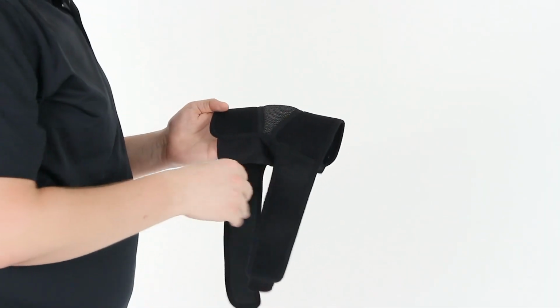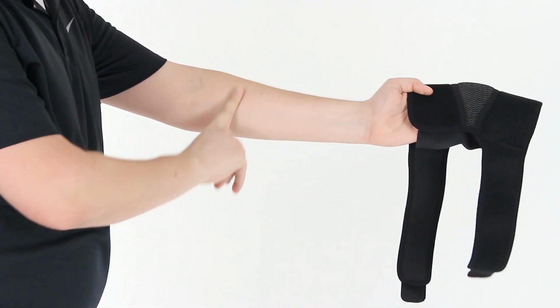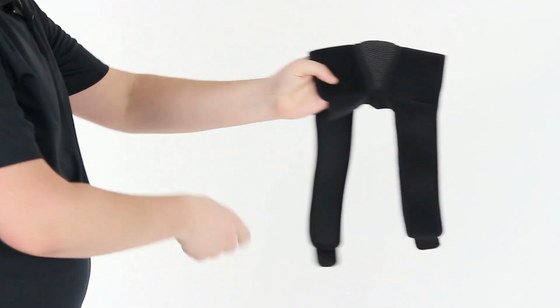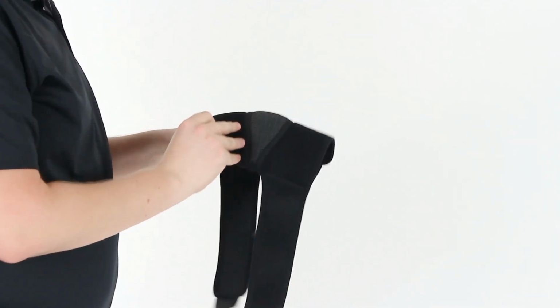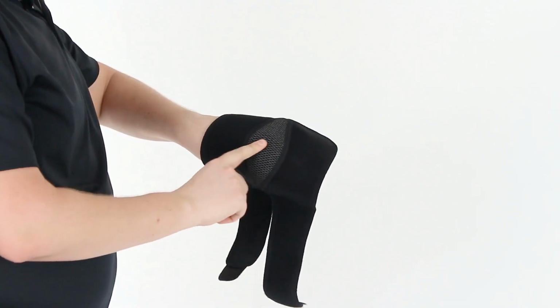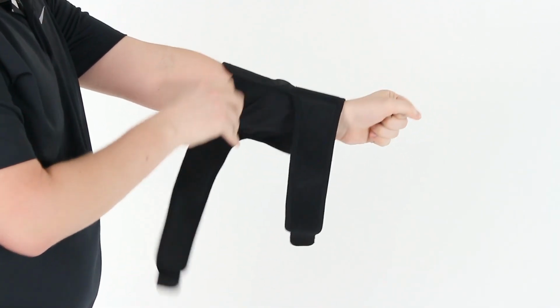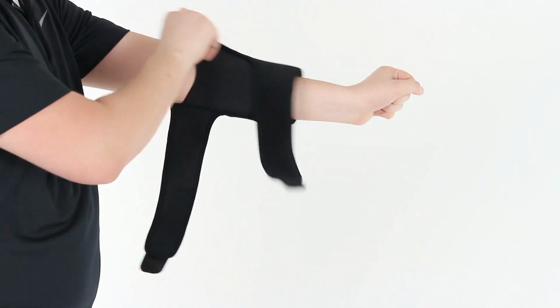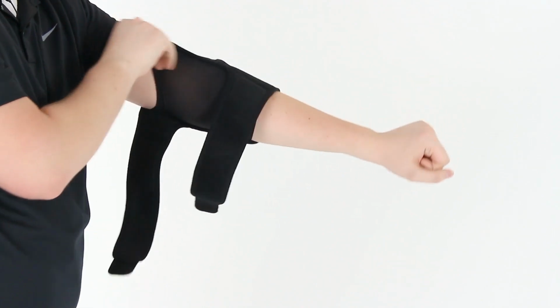So with the elbow brace, you're going to want to fit it with the shorter strap around your forearm and the longer strap above your elbow around the bottom of your bicep. You'll put the point of your elbow in line with the pad here, slip your arm through the stretch sleeve until it's into place.